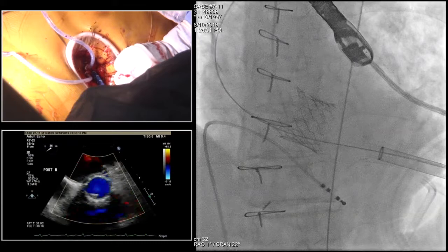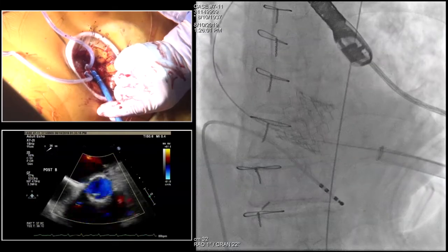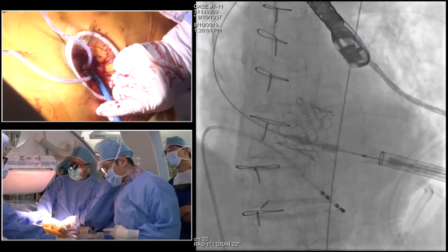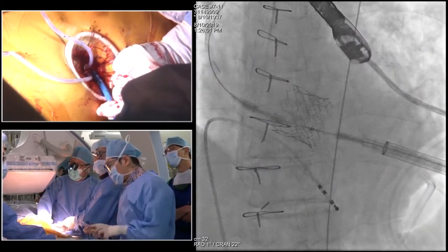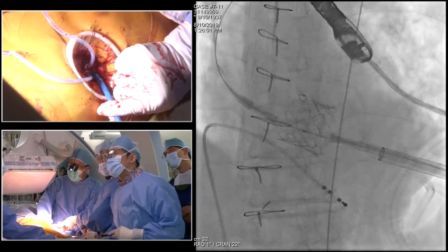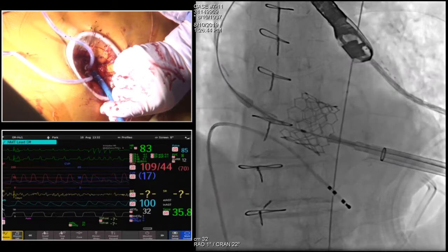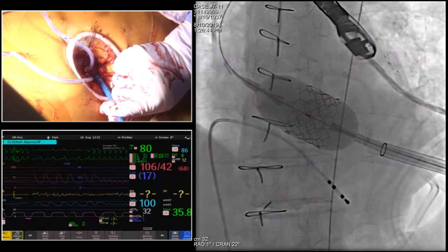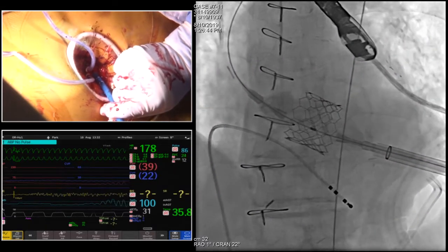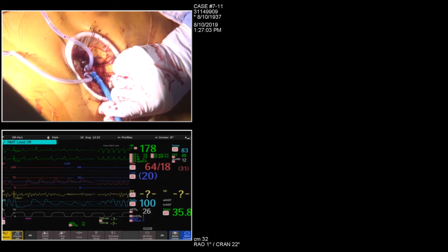와이어 딱 잡고요. 자, 조금만 더 들어가고 에어레이션 할게요. 자, 에어레이션, 디에어레이션. 자, 플로로. 자, 잡고 있죠? 자, 피그테일 조금만 더 빼. 뒤로. 자, 요게 지금 TV 보이는 데가 더 들어가야죠? 여기지? 자, 준비됐지? 자, 오케이. 자, 찍어, 씬에 찍어. 자, 페이싱 온. 자, 인플레이. 쭉. 1, 2, 3, 4, 5. 디플릿. 오케이. 페이싱 오프. 오케이. 자, 와이어 잘 잡고 있고. 자, 천천히. 와이어. 와이어 너무 텐션 걸리면 안 돼.